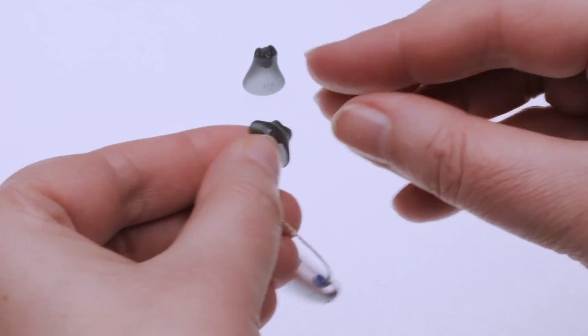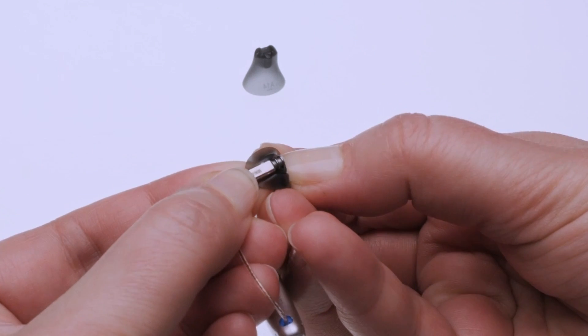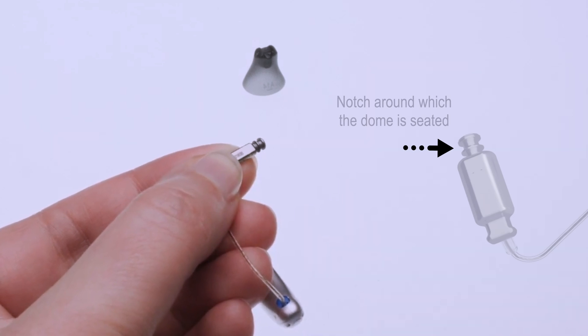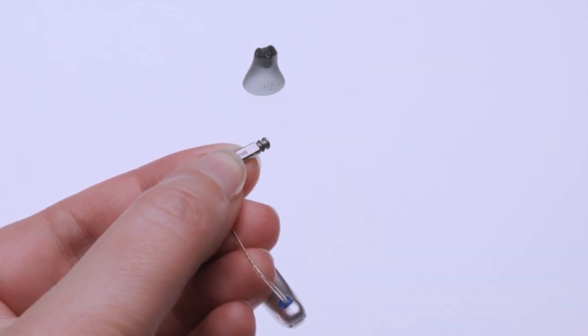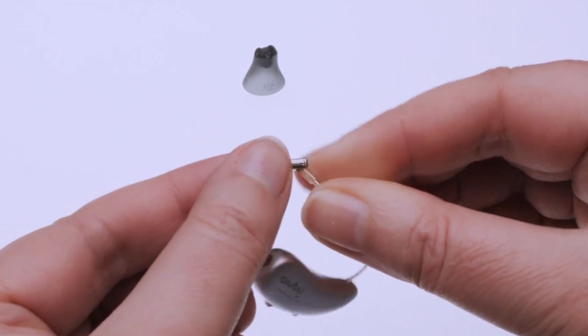Let's talk in more detail about replacing the hearing aid dome. Dome removal requires a gentle bending motion while pulling it away from the receiver. The dome is seated around a notch at the tip of the receiver. When placing the dome back on the receiver, you are trying to push the dome back around the notch.